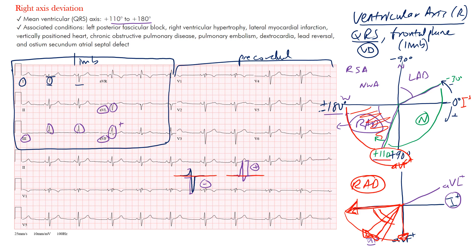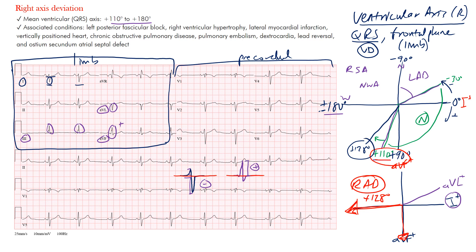The machine calculated positive 128 degrees for this EKG, which falls within the right axis deviation range. To simplify things when you're first learning, use a quadrant system: left axis deviation, normal axis, right axis deviation, and the northwest axis. Use leads 1 and AVF — if complexes are going towards those leads you'll see upright complexes. Look whether they're positive or negative and go from there.